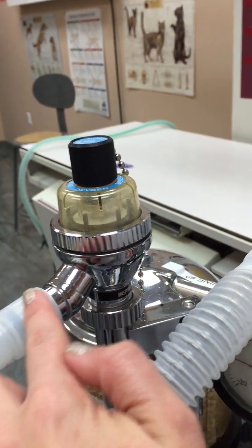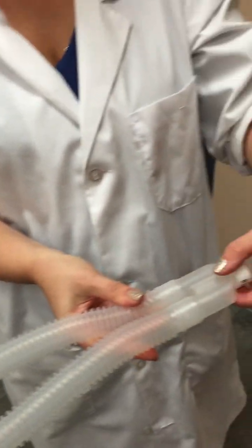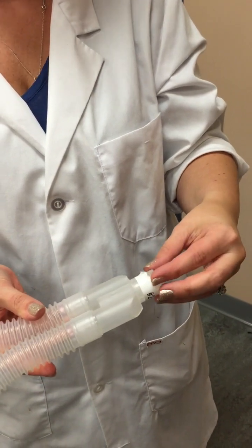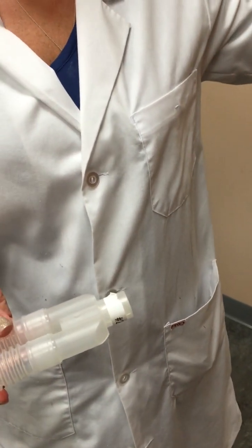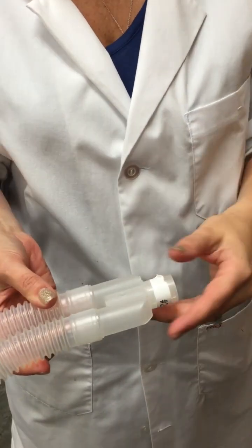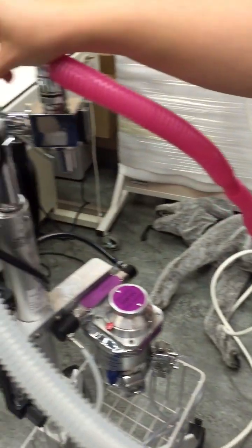The oxygen will then come through the inspiratory limb of your rebreathing circuit, and it will come out the Y piece, and this is the piece that is attached to your endotracheal tube in your patient. So then it will go to your patient's lungs. Your patient will inhale, take in the oxygen and the isoflurane. They will exhale, and the exhaled breath will come out the exhalation limb of the rebreathing circuit.